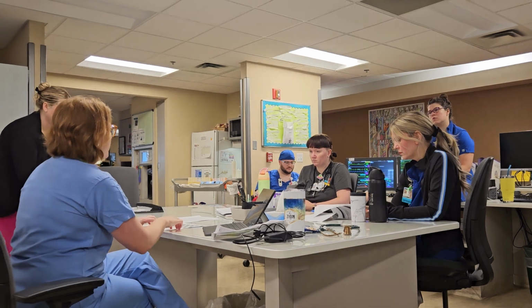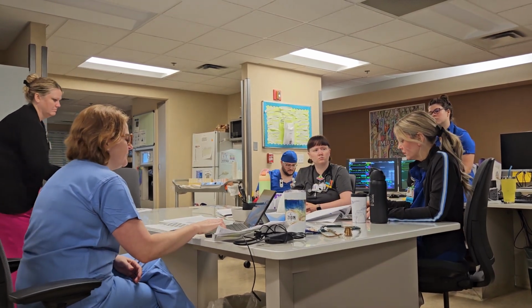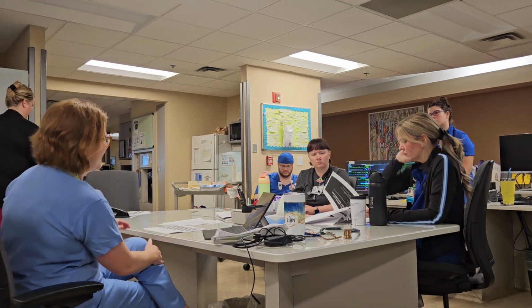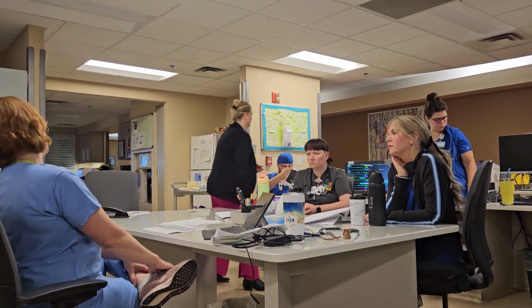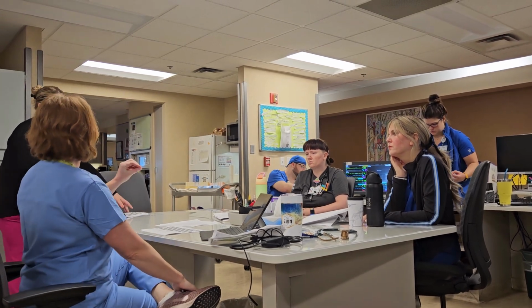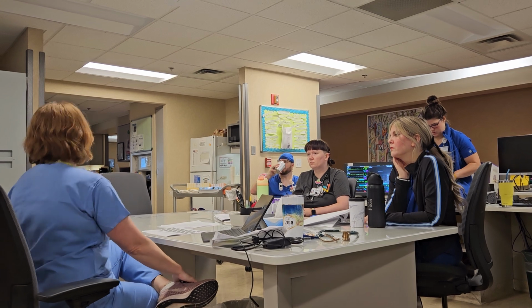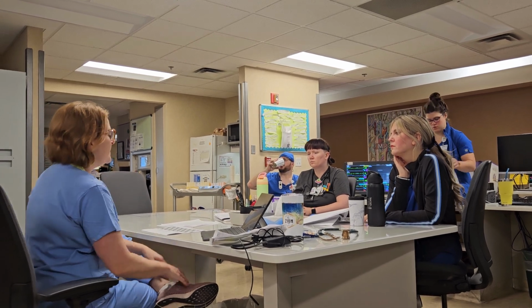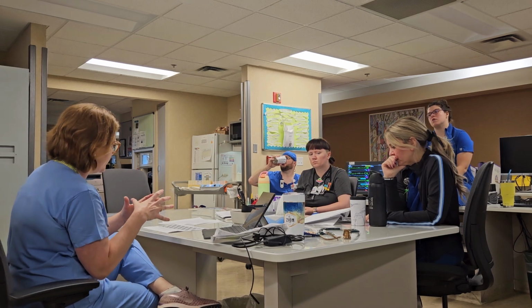So the ventilator adjusts the pressure to achieve the target volume. You're going to see a lot of variable pressures detected within the airways when people are on assist control, because anything can change. A turn, a cough, anxiety can potentially change your airway pressures depending on what the patient is doing.